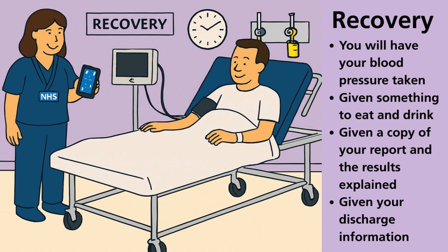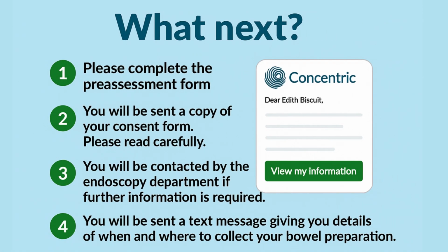If you have had sedation, we will contact the person who will be collecting you to inform them of what time you will be recovered and what time you will need collecting. We will give you a copy of your report, explain the findings, and then give you your discharge information. If you would like someone with you when you are getting your discharge information, please inform the nursing team on admission. You now need to complete the pre-assessment form that follows this video.